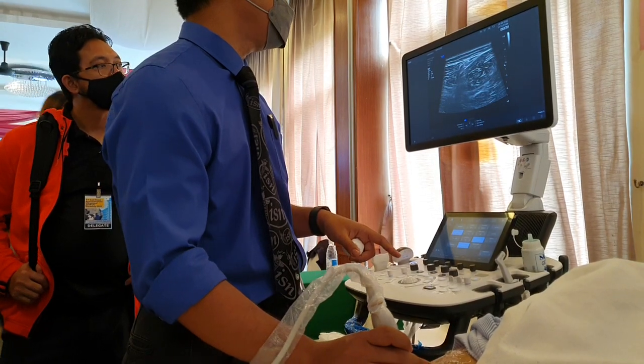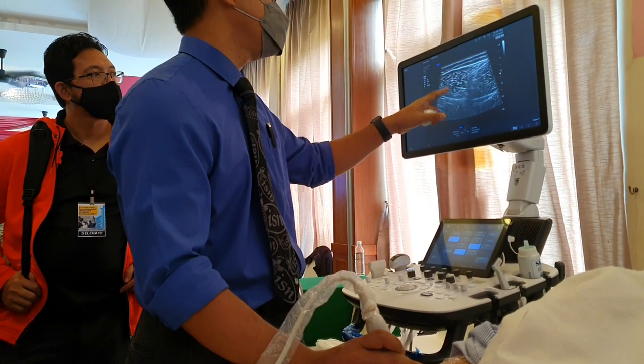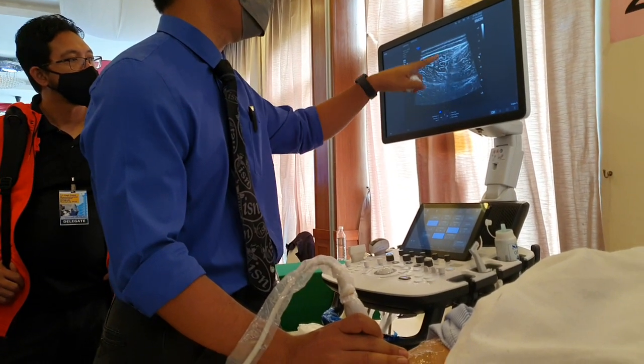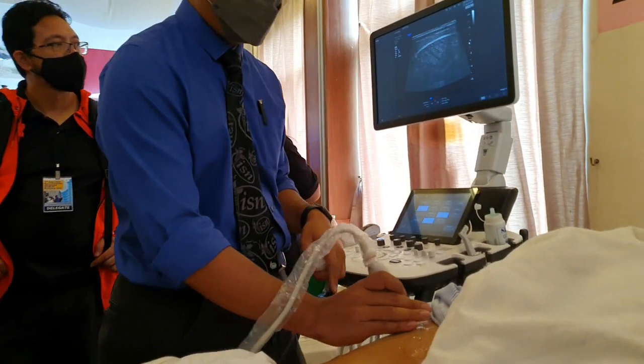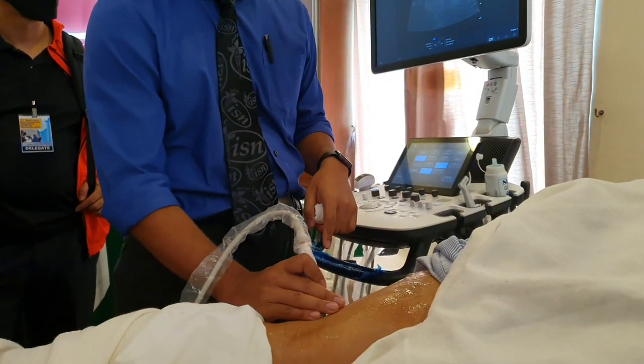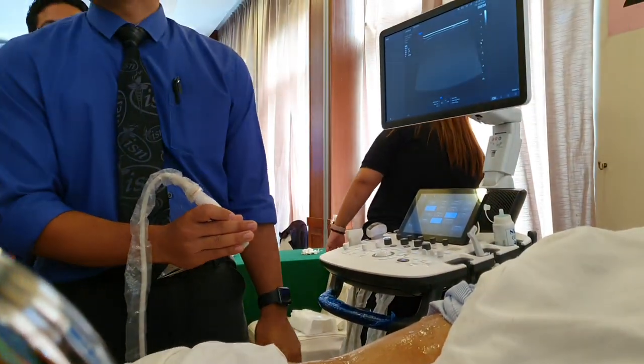Okay, so a bit higher up, you will see here there is a septum. So just lateral to the septum, this area here is your biceps femoris. If you track the biceps femoris down until the attachment, it will attach at the head of the fibula.